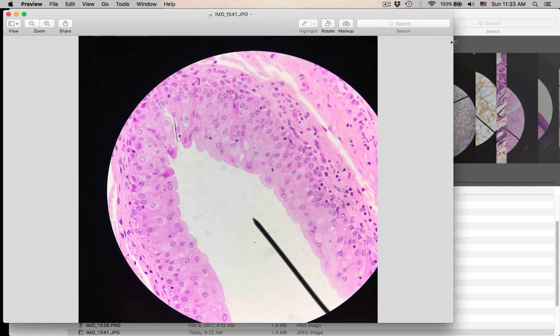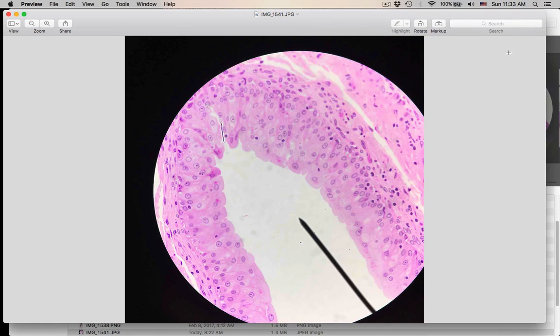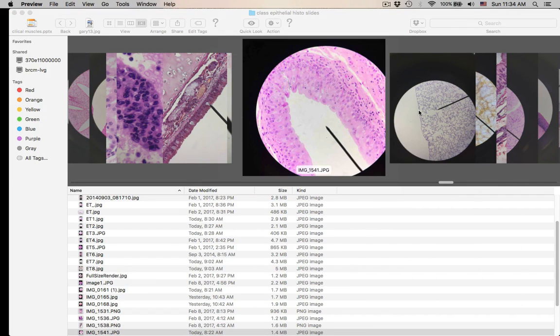Here's another one. Hopefully you're crying uncle by now with some of these. You're going, I get it. Number 25. What is the name of the epithelial tissue facing the lumen, where the pointer is? That was number 25.